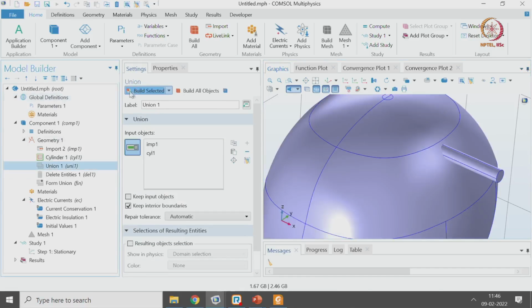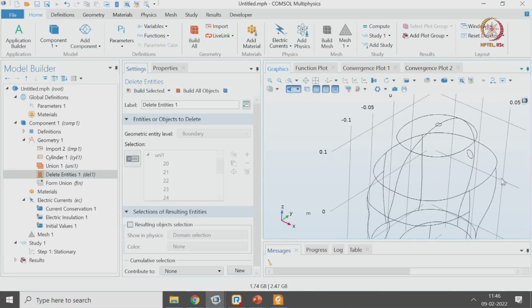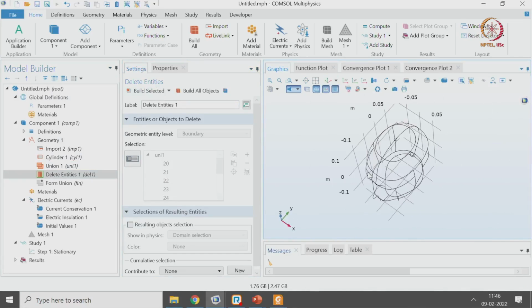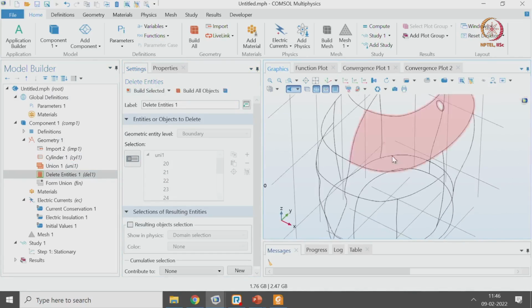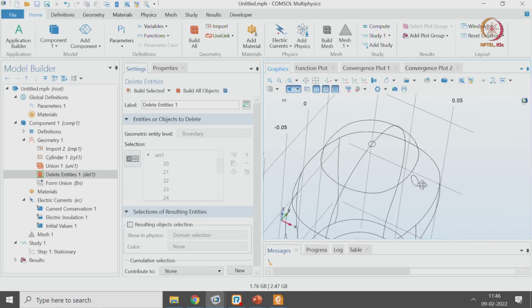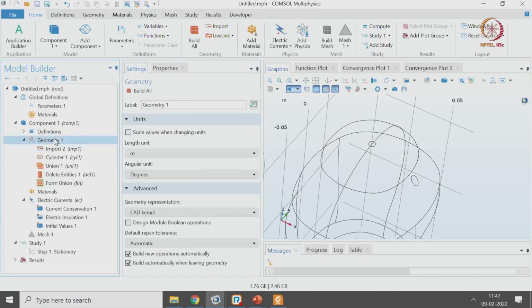So only that surface is what I want to introduce. So I can use a union and delete the domains. These are operations that I can perform, and what I finally get is this particular surface, acting as a stimulus, but it's still not acting as a stimulus. I have just created this surface as of now. I need to apply appropriate boundary conditions to act it as a stimulation, and this is the ground boundary. So that's it with my geometry part.